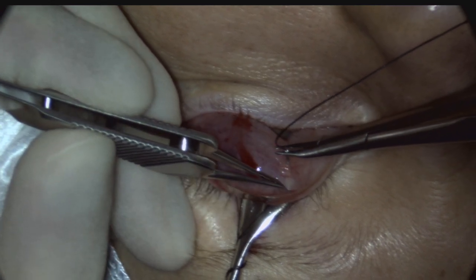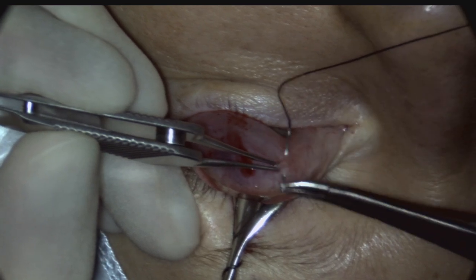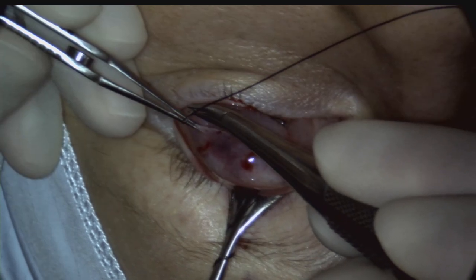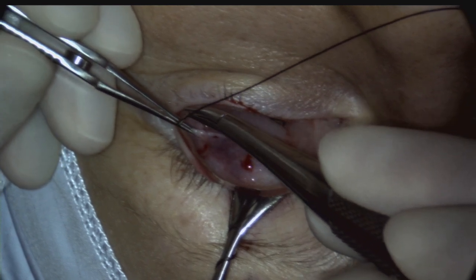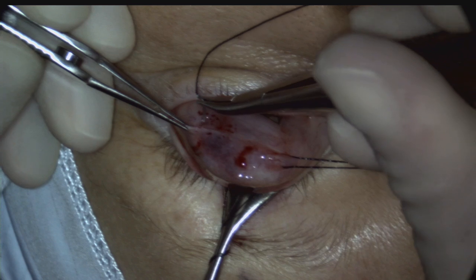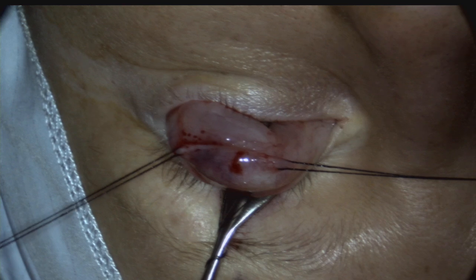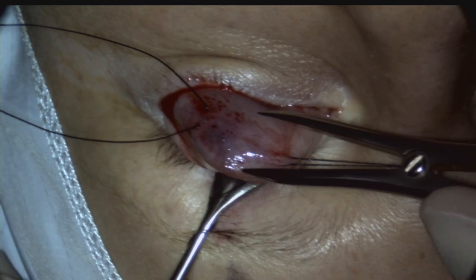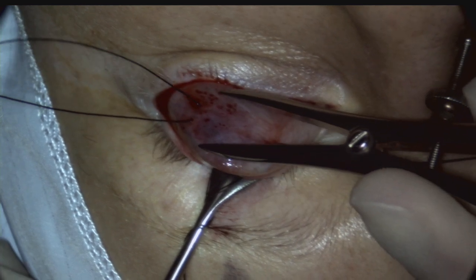A 6-0 silk traction suture is placed through the conjunctiva and Muller's muscle about 6-7 mm above the superior tarsal border medially and laterally. Muller's muscle is firmly adherent to conjunctiva and only loosely attached to the levator aponeurosis. Therefore, tightening this traction suture should enable the desired amount of conjunctiva and Muller's muscle to be excised with minimal or no levator aponeurosis. The desired height of resection is measured with calipers, and an example algorithm will be discussed later in the video.